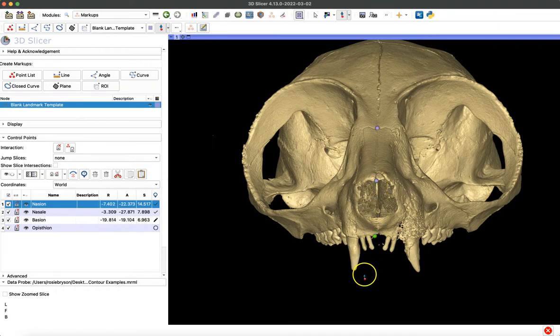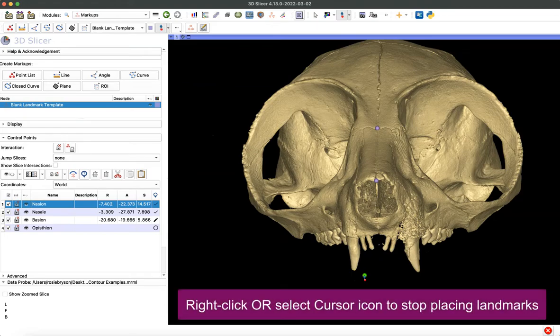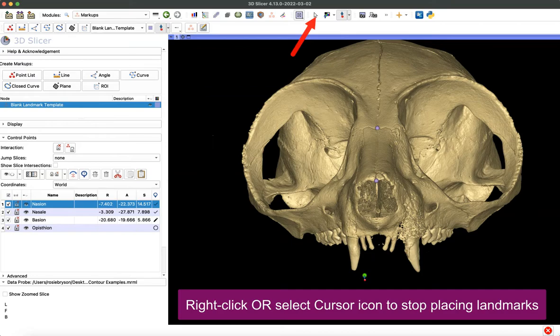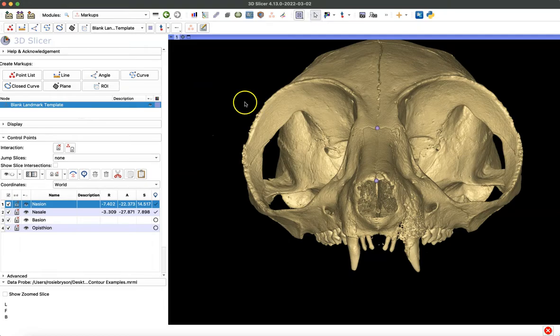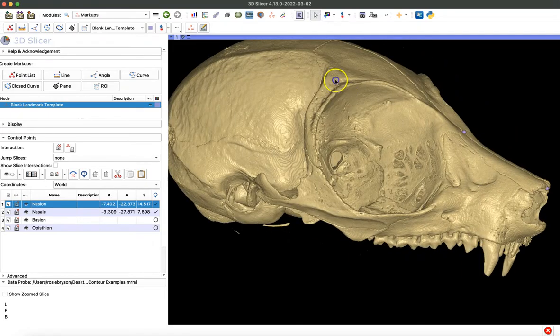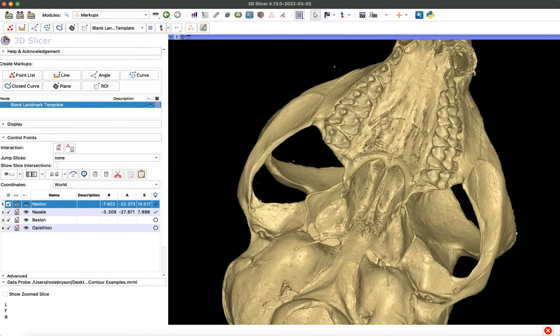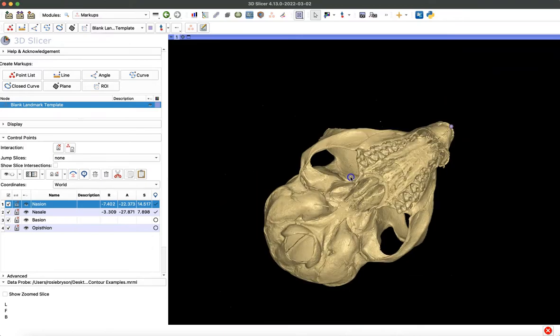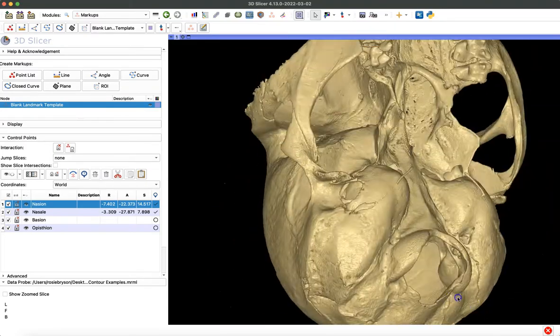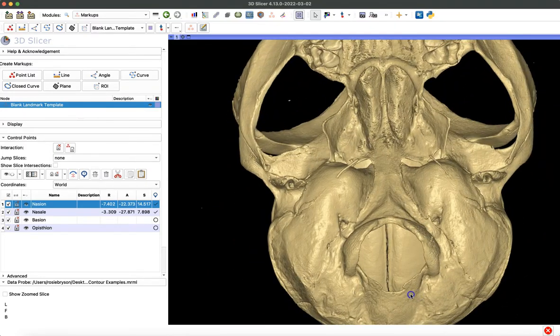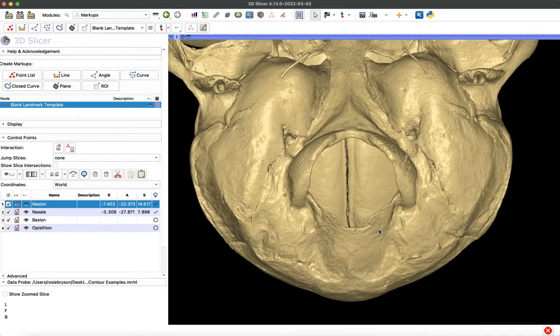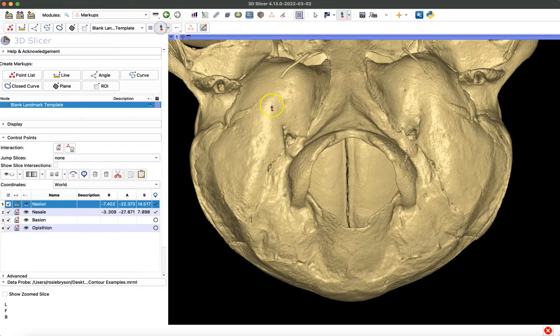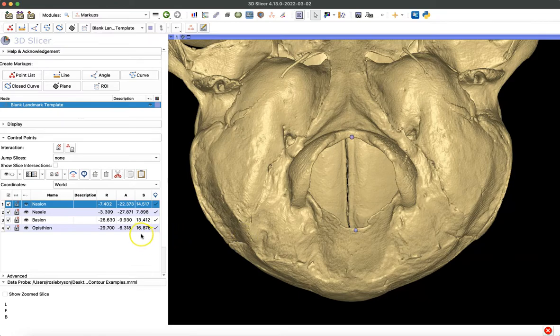In this case, our next points are on the base of the skull, so I want to stop placing landmarks. You can either right-click or use the cursor icon at the top of the screen to stop placing your landmarks. Then you can adjust your model. Here I'm going to rotate to the base of the skull. When I'm in position, I can select that icon again to place my points. Now the first place it'll place a point is for the basion landmark that I've created. Now you can see all my coordinates have been placed.